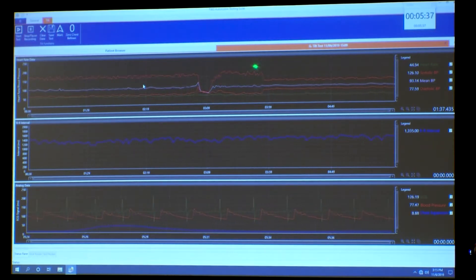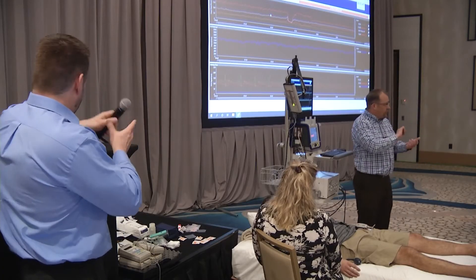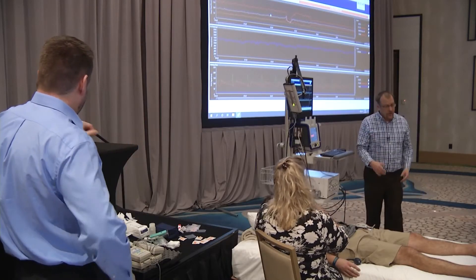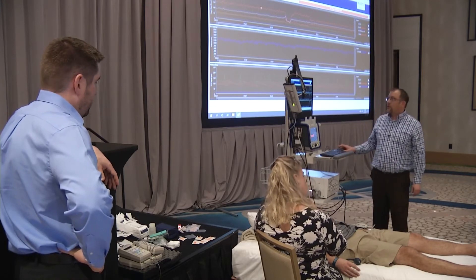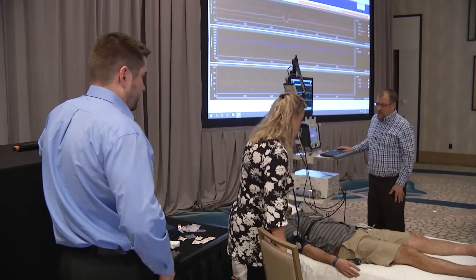You can see where the cuff cut off circulation briefly and then the recalibration occurred — that's the current, more accurate blood pressure. So as far as I'm concerned we can go ahead. Normally we'd have a clipboard recording values and the tilt table would come up, but we're going to go ahead and ask Jade to stand up.